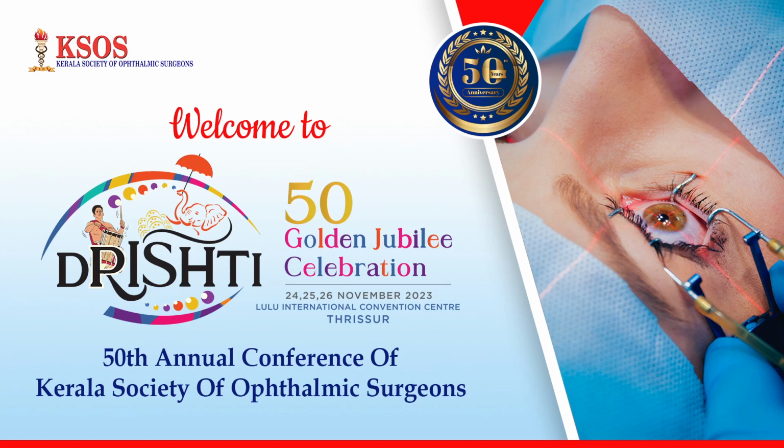So just a brief introduction. Visual rehabilitation in aphakia is a unique surgical challenge, especially in the absence of capsular support. SFILs are ideal because they are placed closer to the nodal point of the eye and at a greater distance from the cornea. Many techniques of SFIL have been described previously.